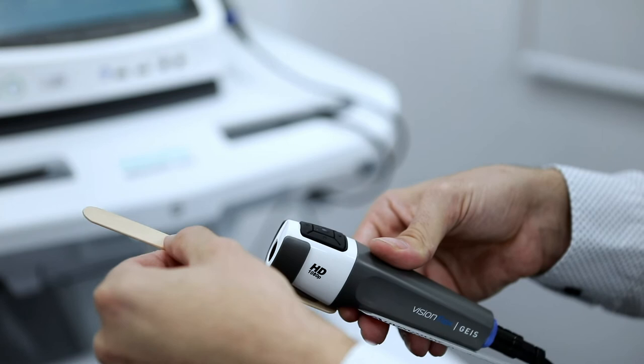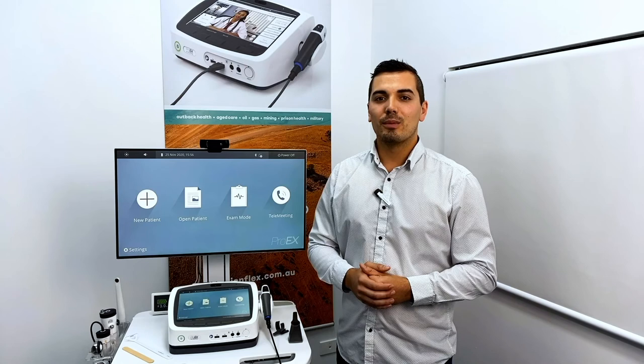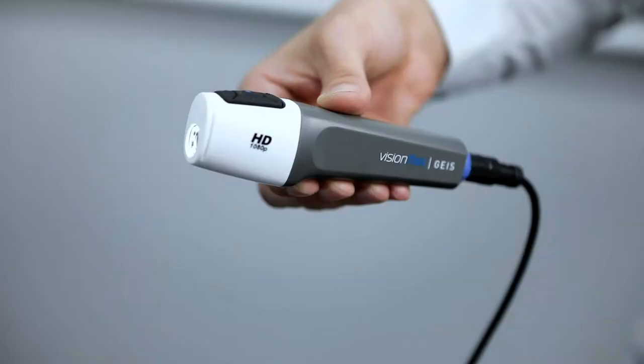The tongue depressors are disposable single-use items. Once an examination is complete, simply dispose of the tongue depressor. The wound measurement stick has a clear disposable sheath which slides over the top of the item. Once an examination is complete, simply dispose of the sheath.